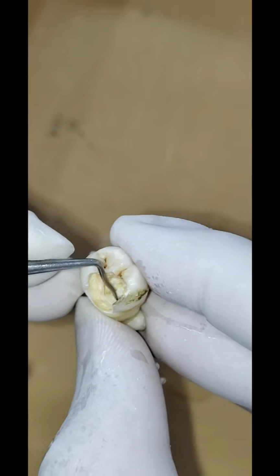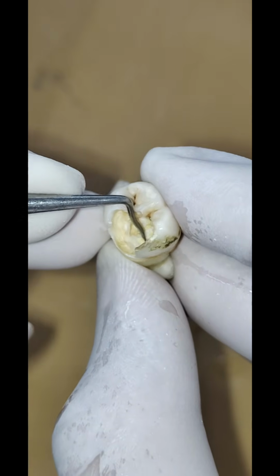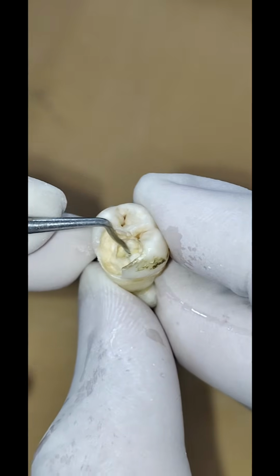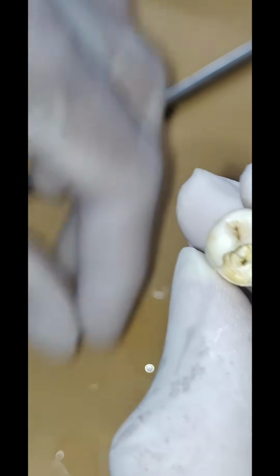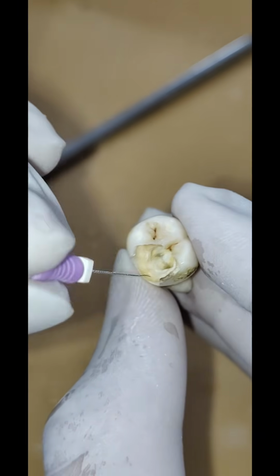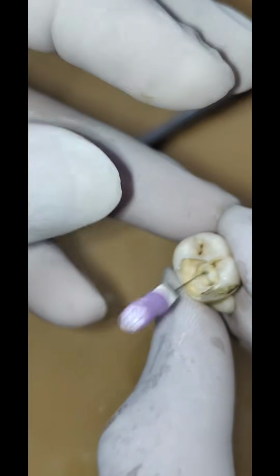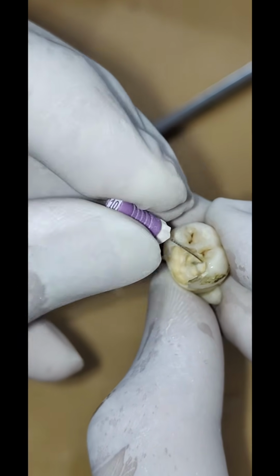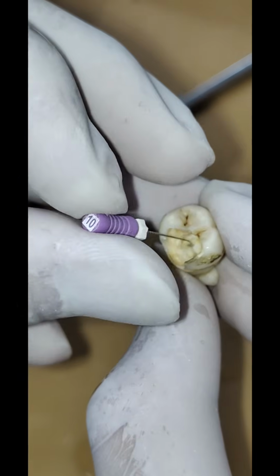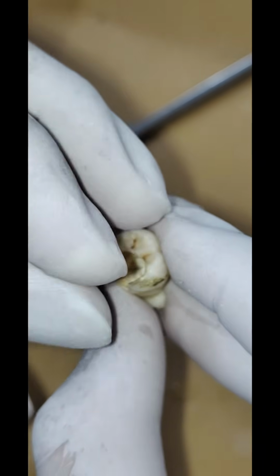And I see a bit of calcification here at the orifices, so I'm using a probe and trying to remove those calcifications. So now let us go on to place the files inside. So first let us place one in the mesial canal, but the canal feels too tight. It might have been calcified so much. So I try to negotiate, but yeah, it's being hard, which will require more time in negotiation.